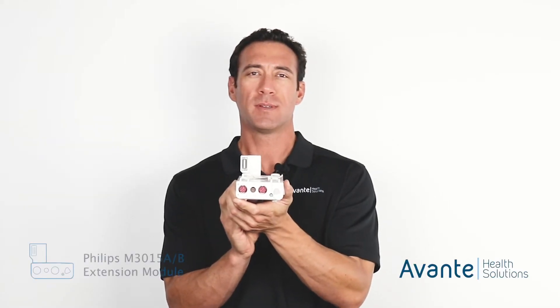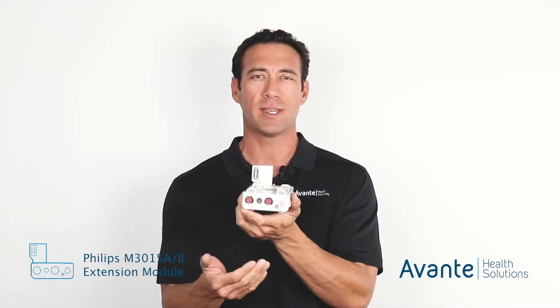Here we have the Philips M3015B. There's also an A version — the B is newer. Anytime in the progression of Philips that you have a B, it just means that it's the newer version.